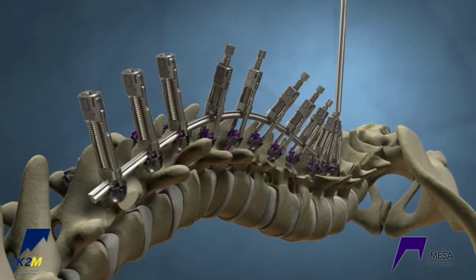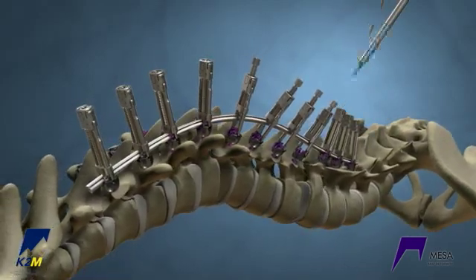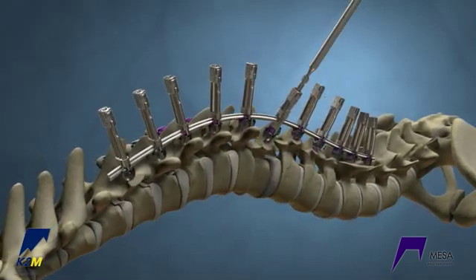Reduce the crickets from top to bottom of the construct, working back and forth towards the apex to restore the thoracic kyphosis. It is important not to point-load any screw.